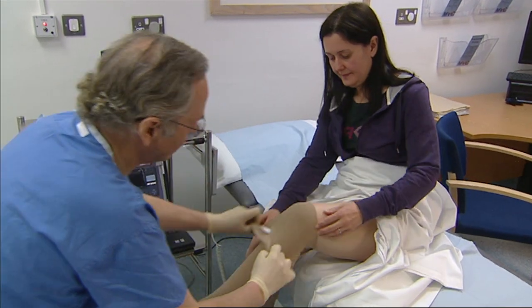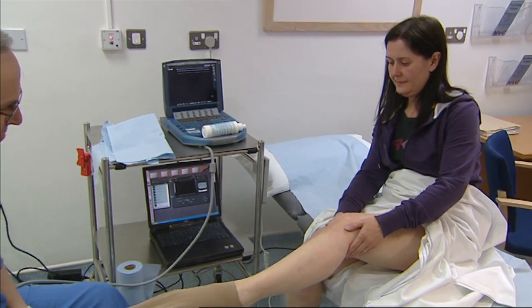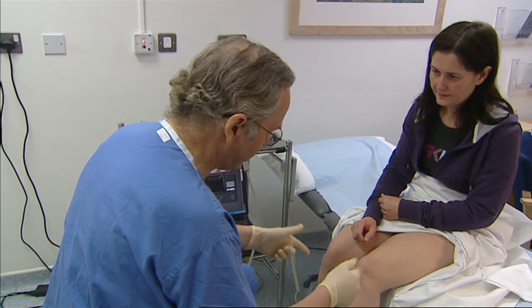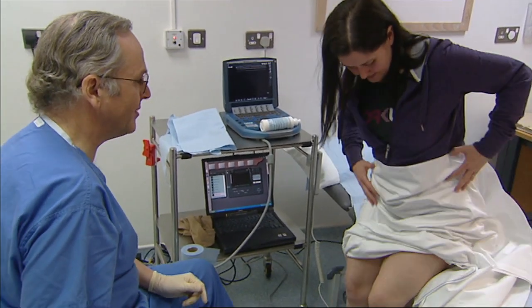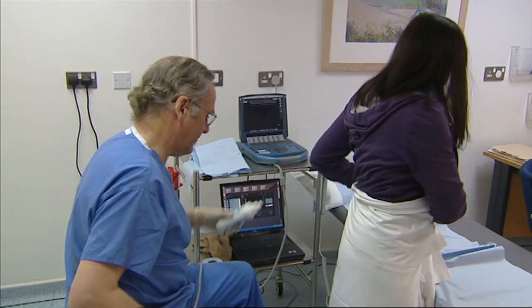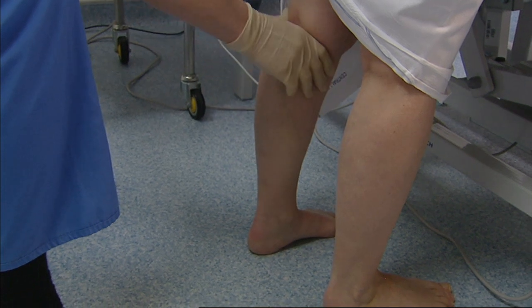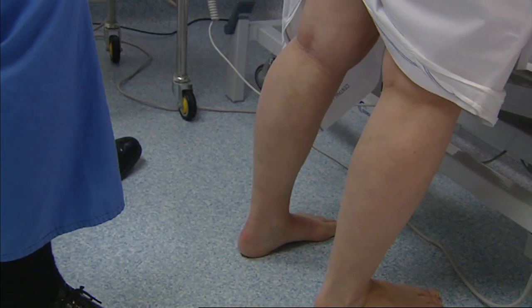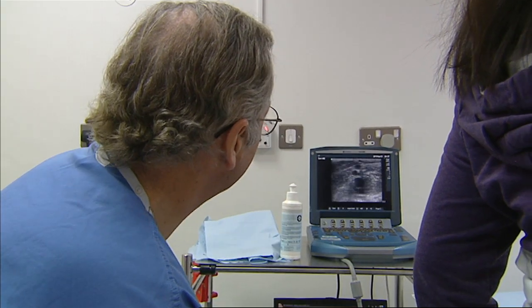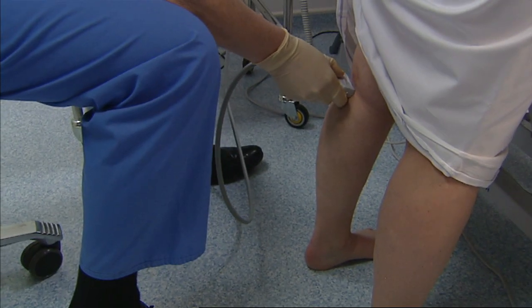Let's take the stocking off and we can look at this. Let me help you whilst we inspect the leg. I think what you're going to do is stand down on the floor and turn and show us the back of that leg, because all the varicose veins are on the back of your left leg. The first stage is to evaluate the patient with them standing up. I'm interested in the patient telling me where their veins are — the ones that are causing them discomfort or an unsightly look to their leg.